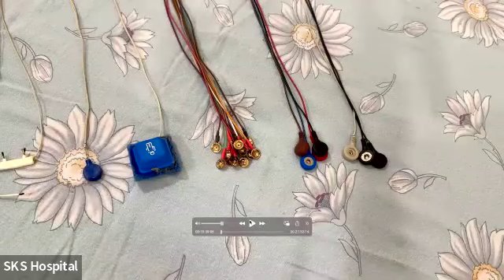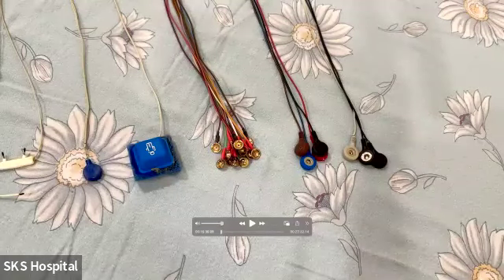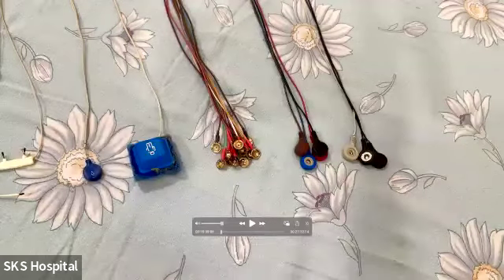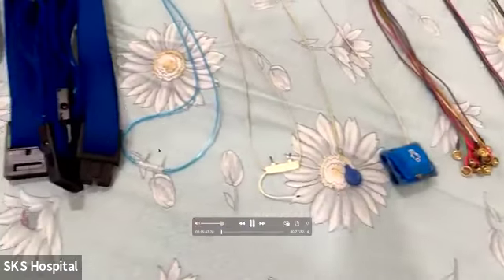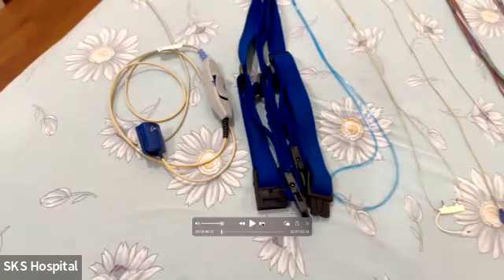Now let me show you the sensors we have connected here. As you can see, on the corner here is the EEG. These are all EEGs. This is a leg EMG and ECGs. This is the position sensor, which will be attached to the thoracic or abdominal belt. This is the snore sensor. This is the thermistor. This is the nasal cannula. These are the belts, and this is the SpO2 sensor.